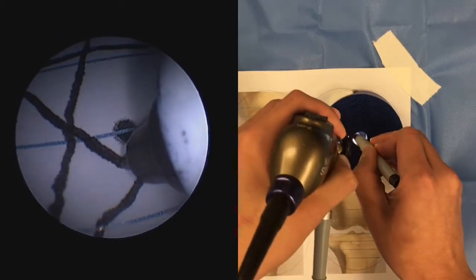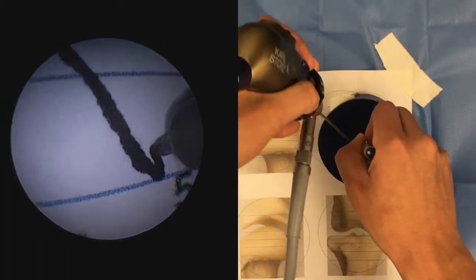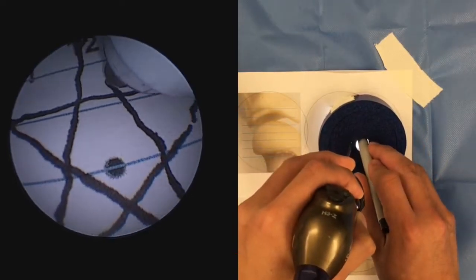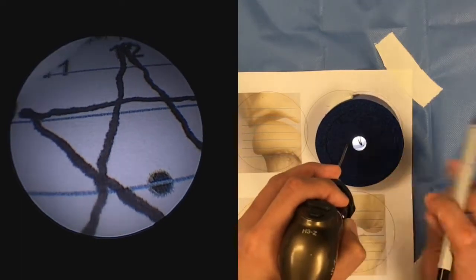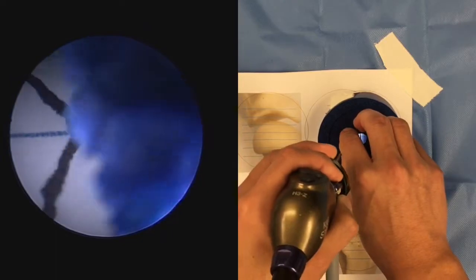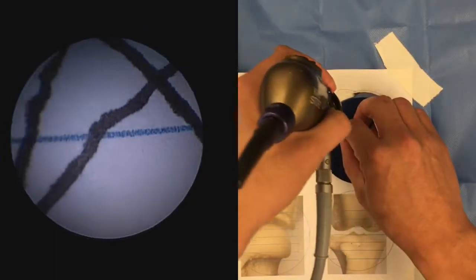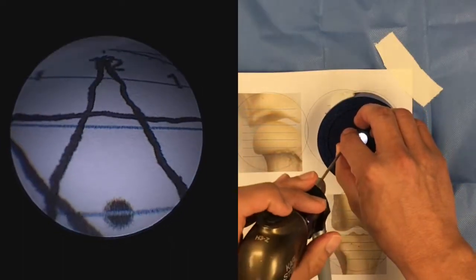This exercise is a nice way of trying to develop spatial awareness as well, so an understanding of what's going on around the entire joint or the entire space beyond, outside of what you can simply see in your tight field of view.